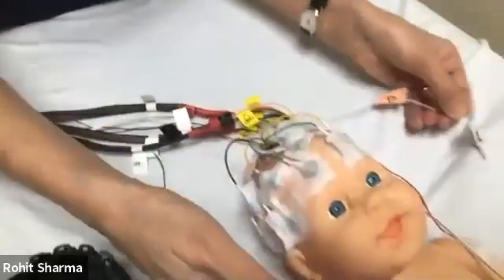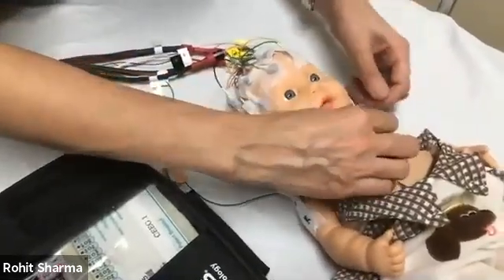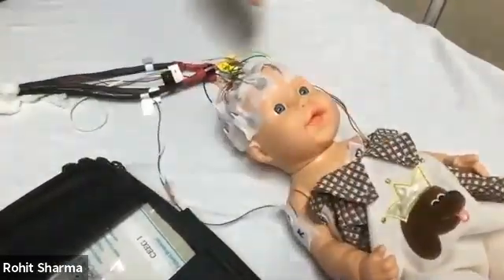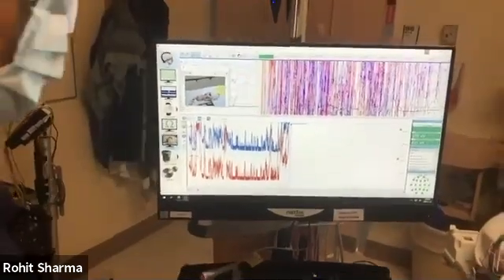And then the extra monitors that were off, you can just stick them back on. That's why we have little labels on them, flags, that help you to put everything on. So then you will notice that the EEG will be back again to recording. When you are gone to CT or MRI, the EEG doesn't show recording at all.